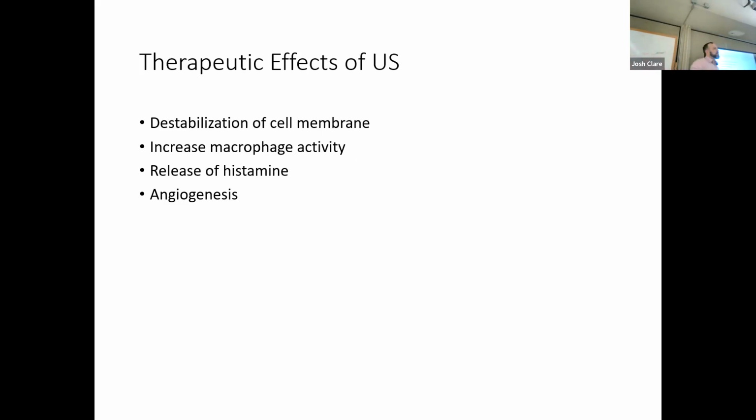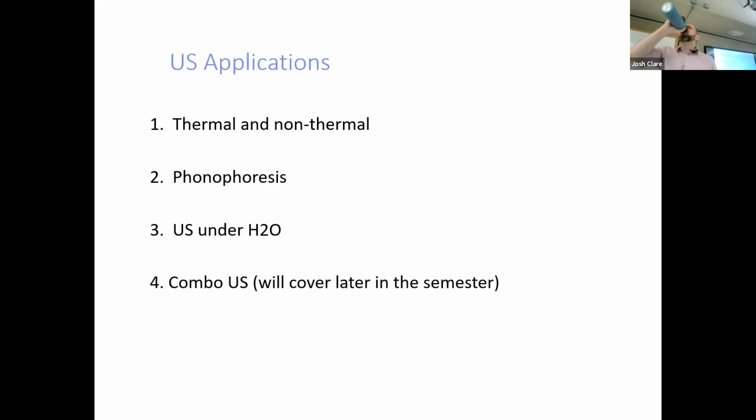So some of the therapeutic effects of ultrasound: we're going to destabilize the cell membrane, increase the cell permeability, increase macrophage activity, release of histamine, angiogenesis, create new blood flow. So all of that stuff is the beneficial effects for it.